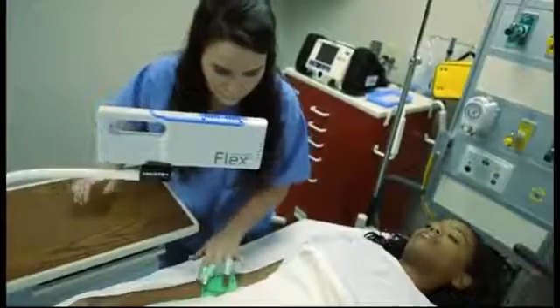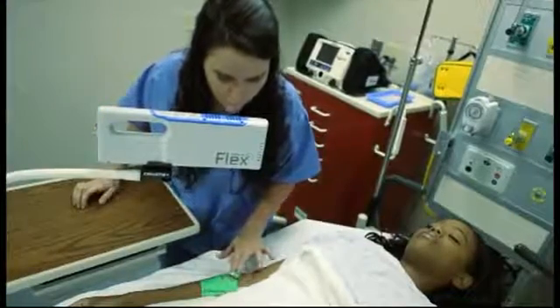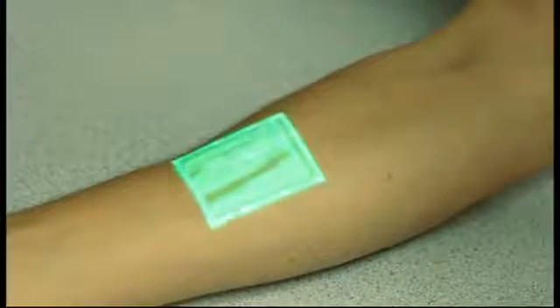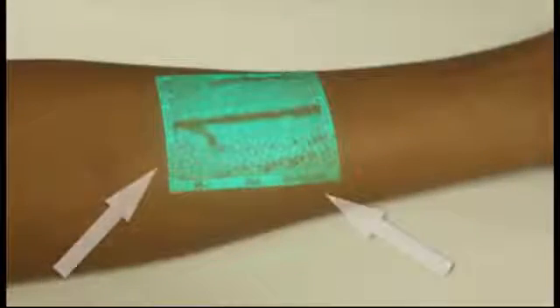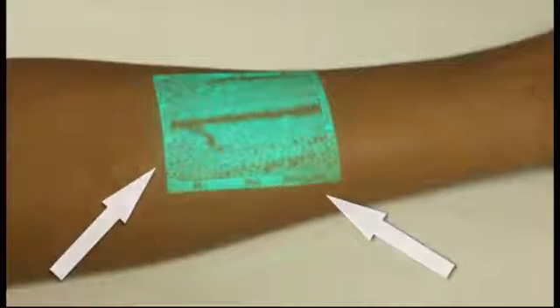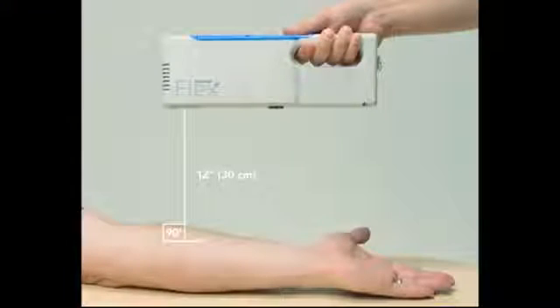To achieve proper focal distance for VainViewer Flex, hold the unit close to the surface of the skin and move the unit away until the border text around the image reading VainViewer and Christie becomes clear and legible. You should be at the proper focal distance of 12 inches or 30 centimeters.